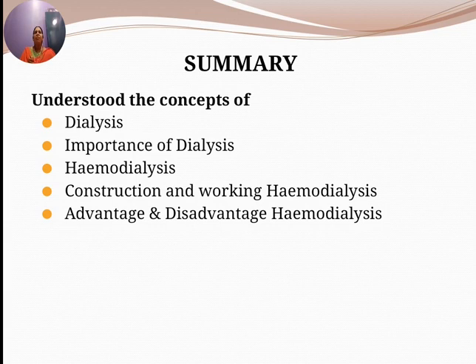So the principle of hemodialysis is that the artificial kidney or hemodialyzer works on the principle of dialysis, which is the diffusion of small solute molecules through a semi-permeable membrane. Blood is removed from the body and pumped by the machine outside the body into a dialyzer called the artificial kidney. The dialyzer filters the metabolic waste products from the blood and returns the purified blood to the person again. So the total amount of fluid returned can be adjusted. Typically hemodialysis is undergone at a dialysis center.